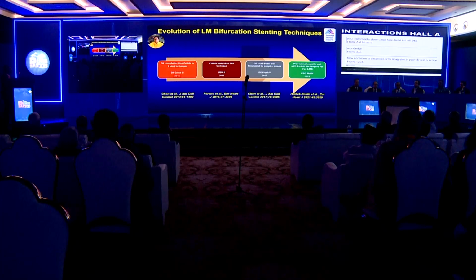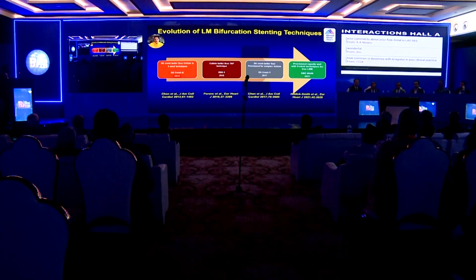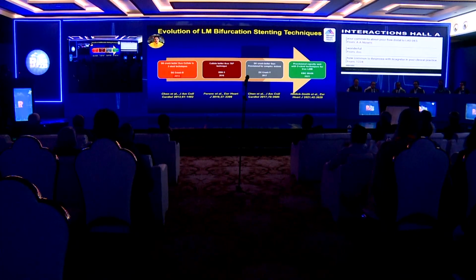So, the evolution of left main bifurcation technique over the years. If you see here, in 2013 we started with the DK Crush 3, which showed DK Crush was better than Culotte in two-stent technique.